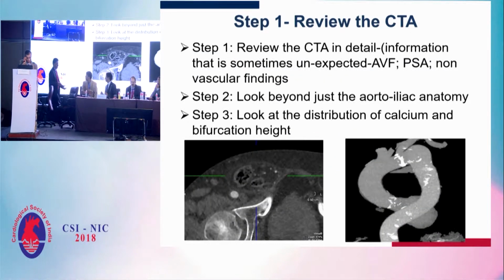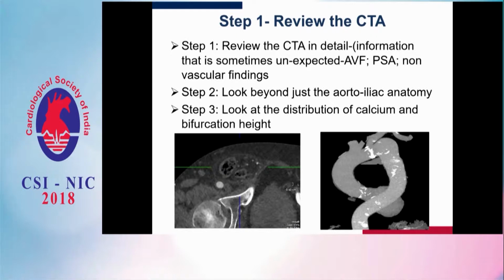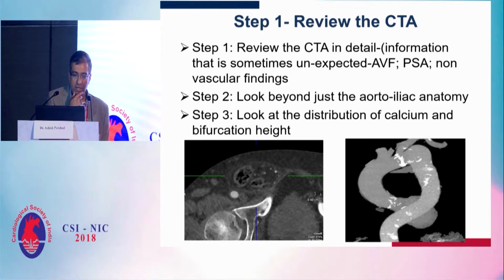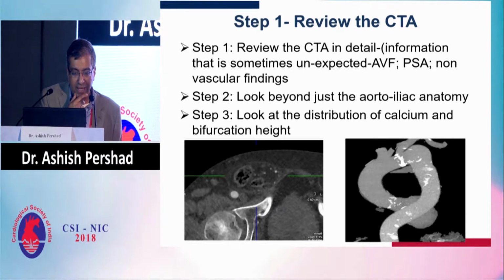So, luckily with TAVR, we have the luxury of doing a very detailed CT analysis of the patient. And so the very first thing that I highly recommend is a very careful review of the CT angiogram. And by that I mean reviewing the CT even before it gets put into the dedicated software that is created, but just look at things that you find that sometimes can be unexpected.